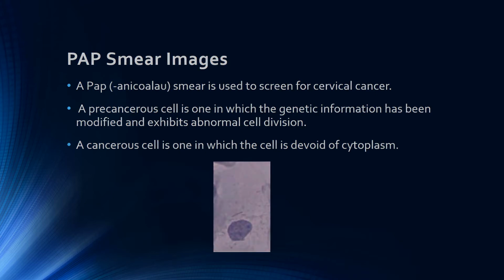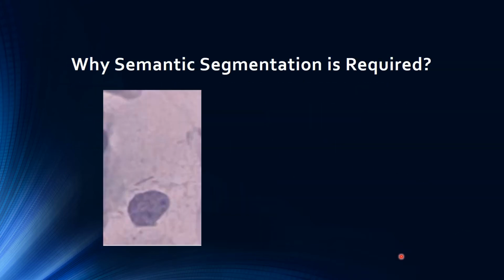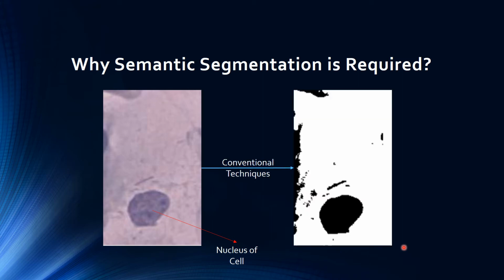And it is difficult to segment this using conventional techniques. You have conventional techniques to segment images, like region-based techniques such as active contours, and other thresholding techniques. If you perform all those, the mask you'd get, this is the best possible version you can obtain using conventional techniques. So you can clearly see that the faint cytoplasm is left out totally.